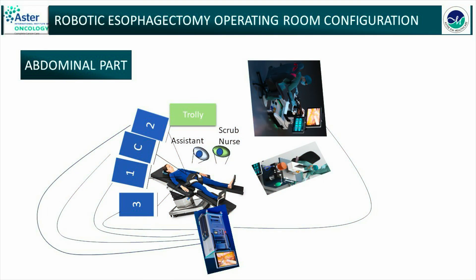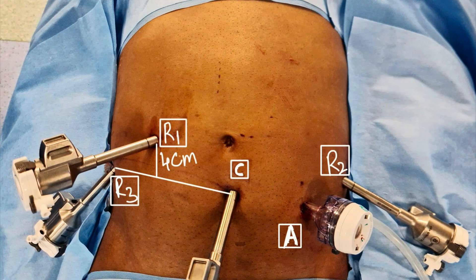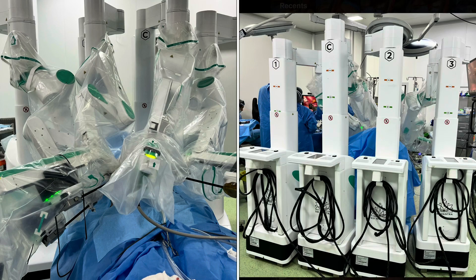The thoracic phase is completed. The patient is placed in supine position, the tube is changed to a single lumen tube, and the robot is redocked from the head end. The assistant and scrub nurse stand on the left side of the patient. The patient is placed in reverse Trendelenburg position with the right limb at a lower level to avoid any clashing with the arm. This is our standard robotic port placement for the abdominal part. The camera arm is docked from the head end, followed by the other arms, equally spaced to avoid any external clashing.